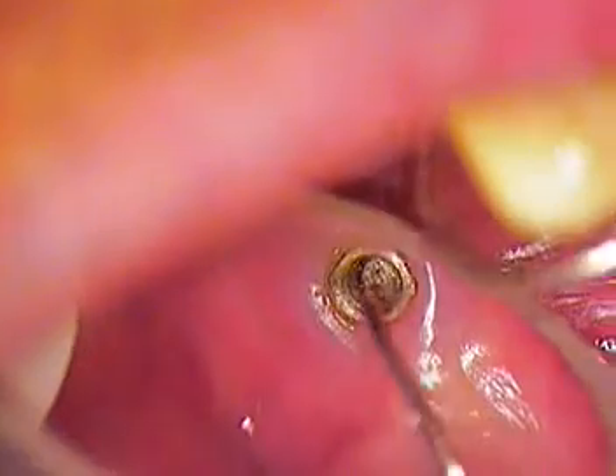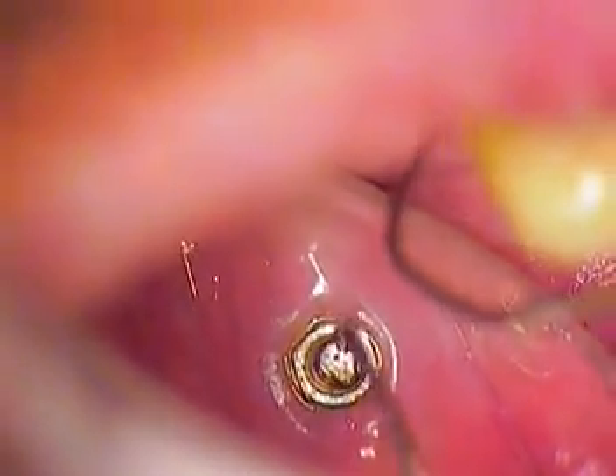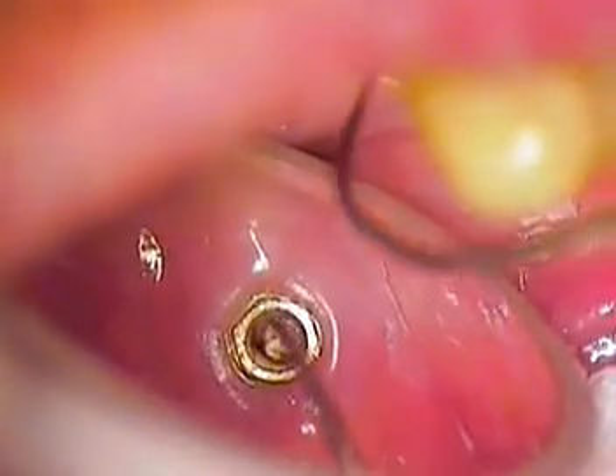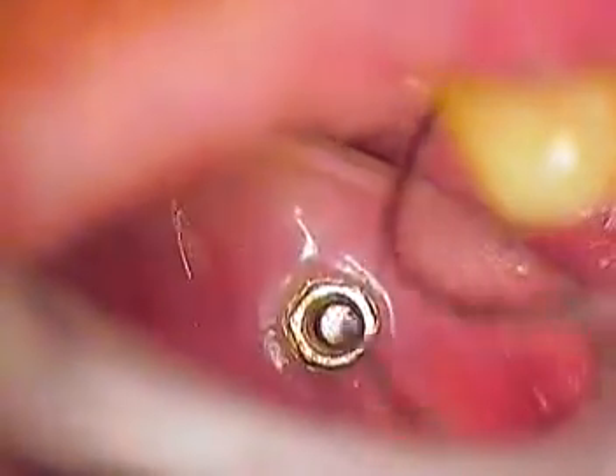Once we remove this — see now how they're noticeably loose and they're starting to back out. So let's continue our treatment and we'll keep filming until we get both out. It's always counterclockwise, but it looks clockwise in the mirror. So counterclockwise.